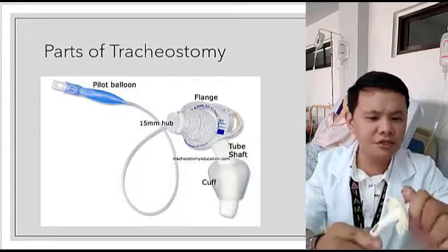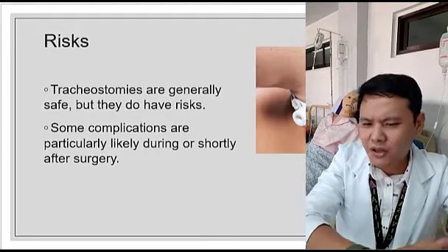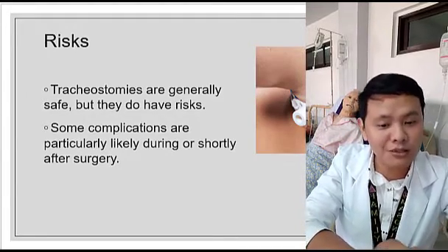Okay, so those are the parts of the tracheostomy. Let's now talk about the risks. Tracheostomies are generally safe, but they do have some risks.